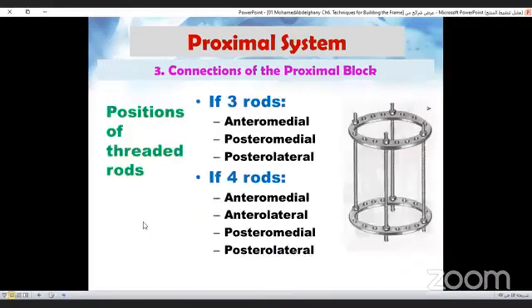If three rods are used, they are applied anteromedially, posteromedially, and posterolaterally. While if four rods are used, apply them anteromedially, anterolaterally, posteromedially, and posterolaterally.